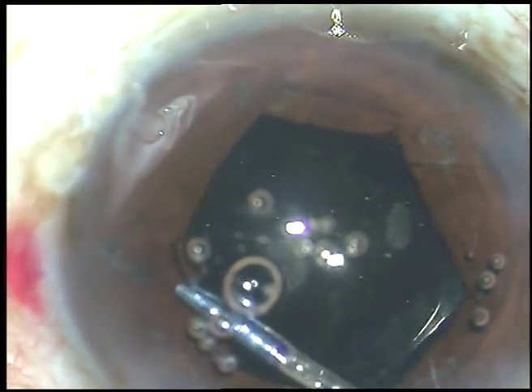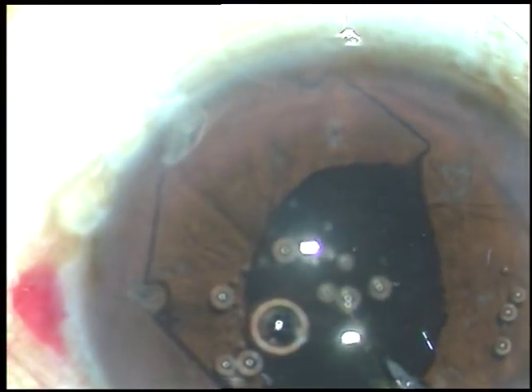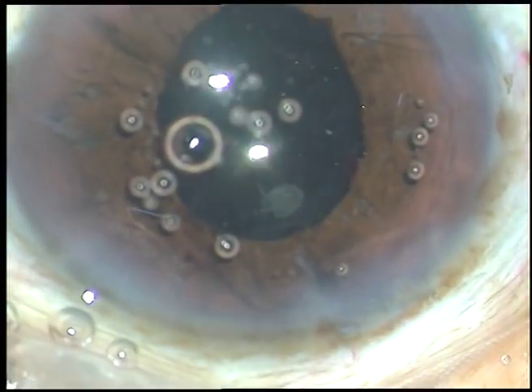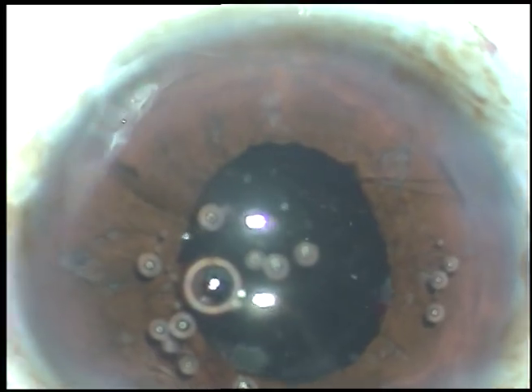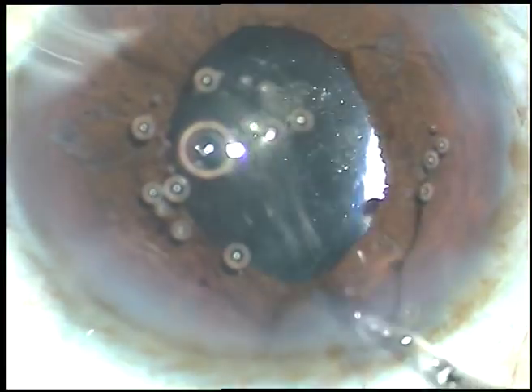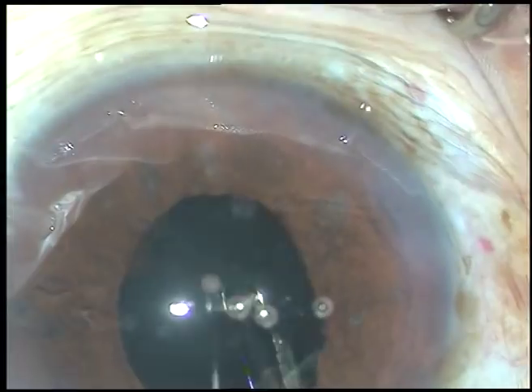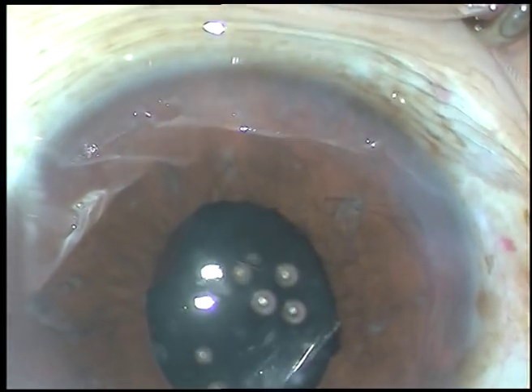Now I am pulling out the BX ring. First I untuck and then hold superiorly and gently remove it. It is a very user-friendly device — you can easily introduce and easily remove it. The trick is the 23-gauge crocodile forceps; it makes application and removal of the BX really simple.